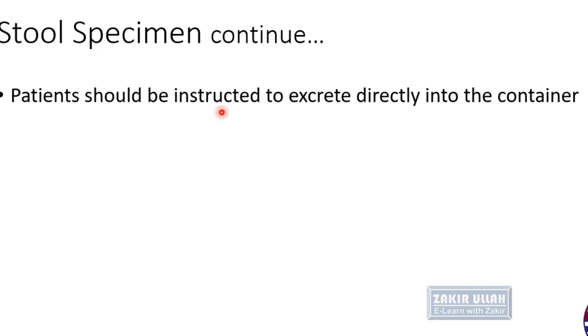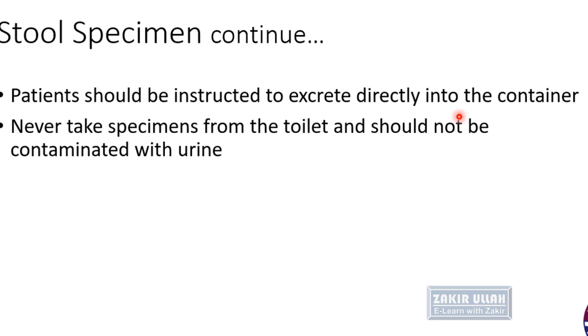Patients should be instructed to excrete directly into the container for the collection of a stool specimen. It should be understood that specimens should never be taken from the toilet and should not be contaminated with urine, because a toilet contains millions and billions of bacteria, which would contaminate our stool specimen.